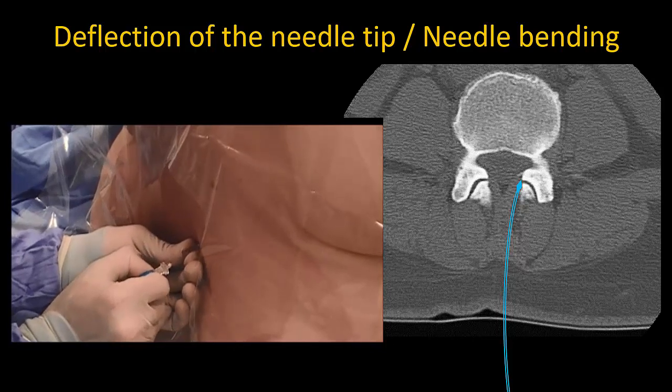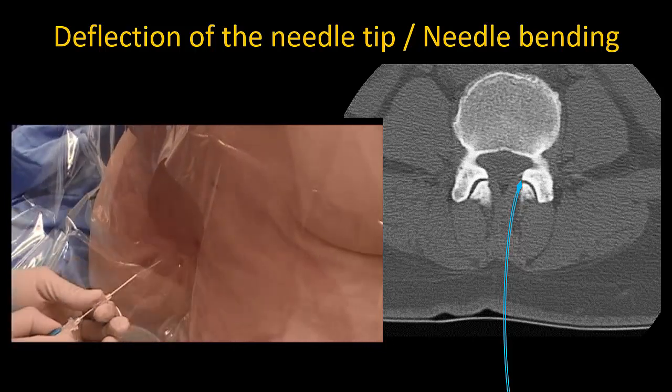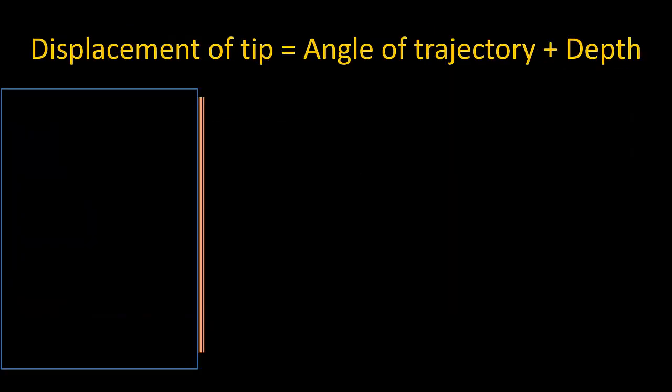Controlled insertion without excessive force is the key to avoiding this problem. The second thing to be careful of is making excessively large changes in needle trajectory.